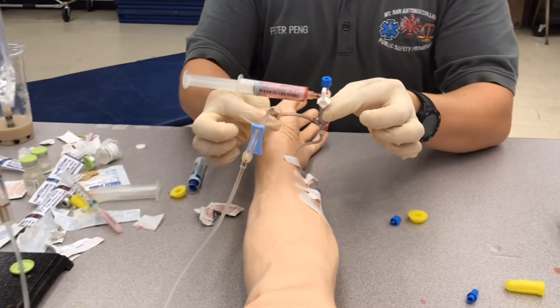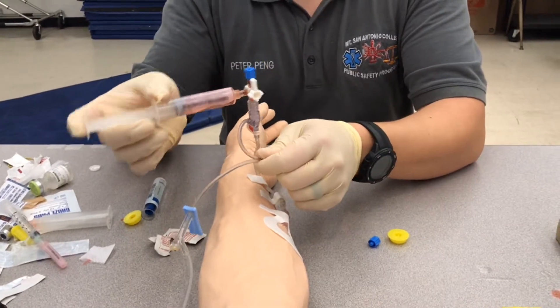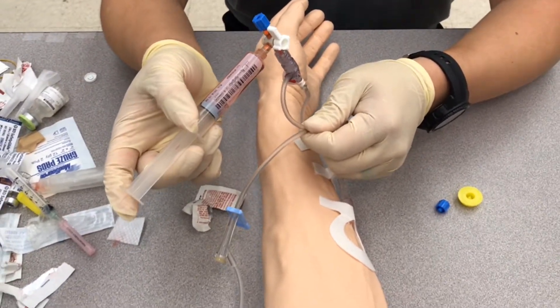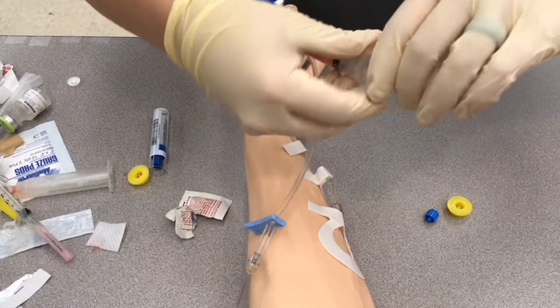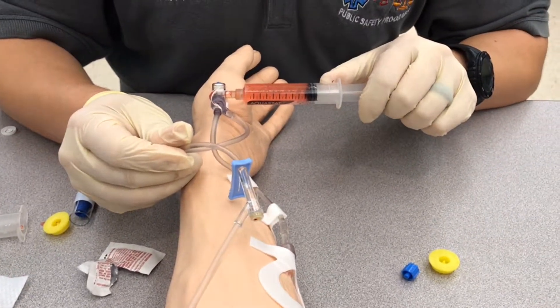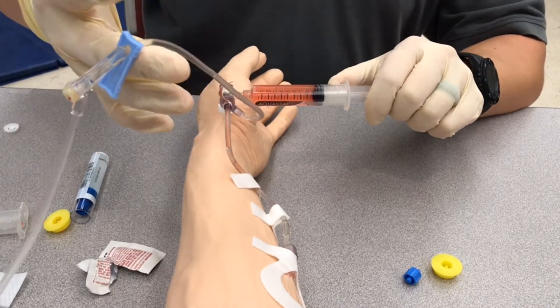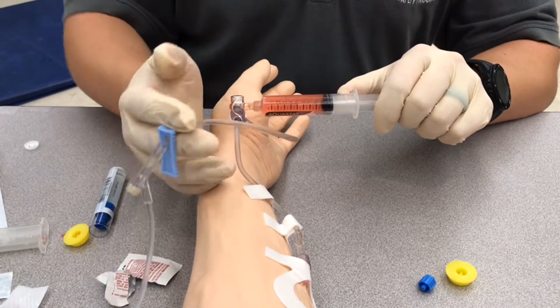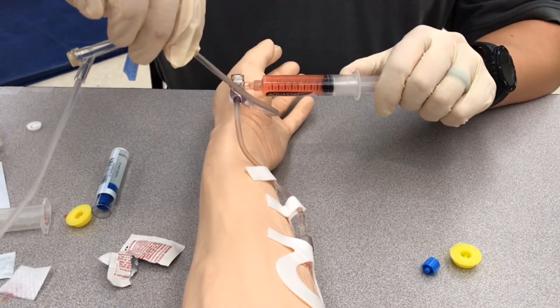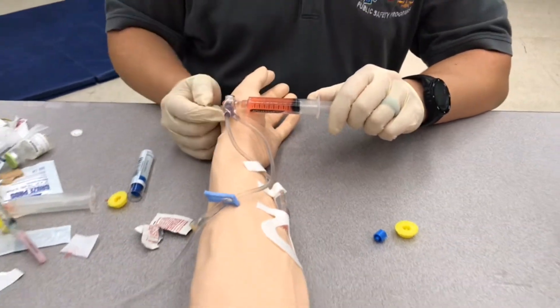I'm going to pinch this line above the site of injection. Per protocol, we're going to administer 1 mL of epinephrine over about a minute, and we can repeat that every one to five minutes until you get a systolic blood pressure over 90. So I'm going to slowly push down to the 9 mL mark over about a minute. Every couple of seconds I'm going to let go of the pinch — you can see that because our bag is running, it's pulling some of that medication. Pinch it again, push a little bit, and release. That way you're getting a steady flow of medication into the patient's IV.